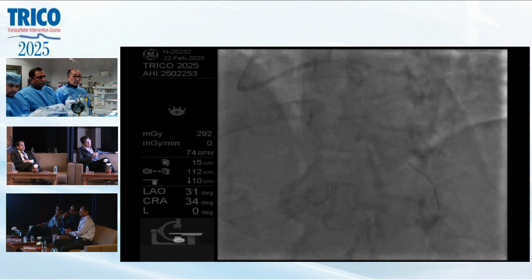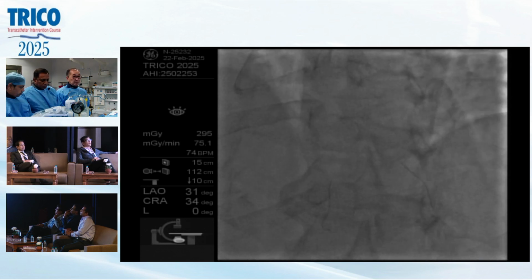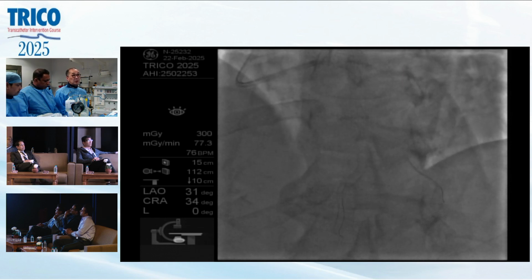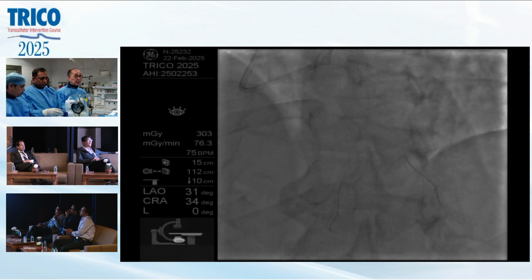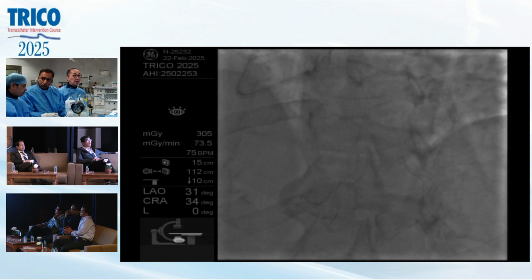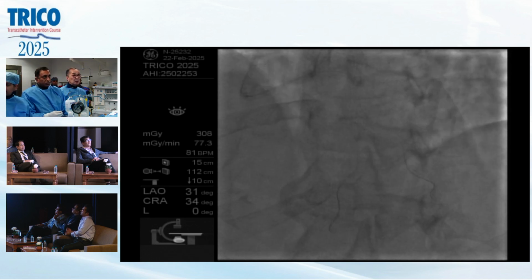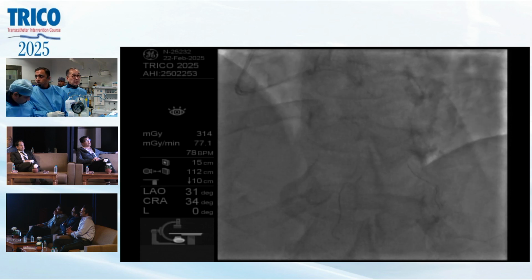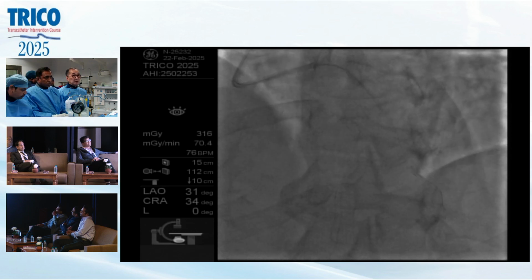Somebody said that there's a very big side branch, correct. The side branch is the only diagonal in this artery. This is a major diagonal, so it supplies definitely more than 10% of the myocardium. So this one is very important.